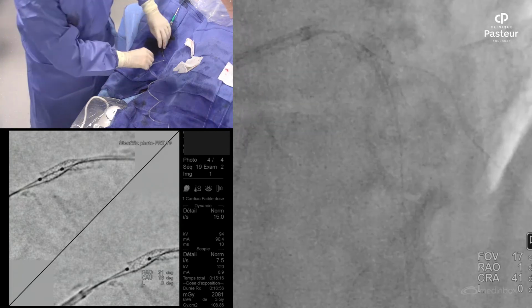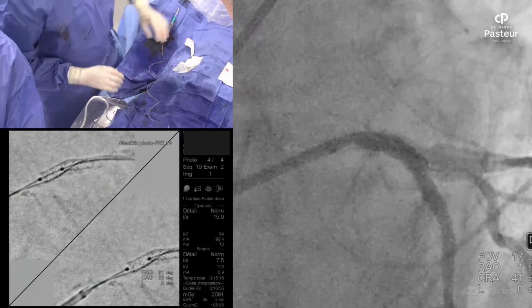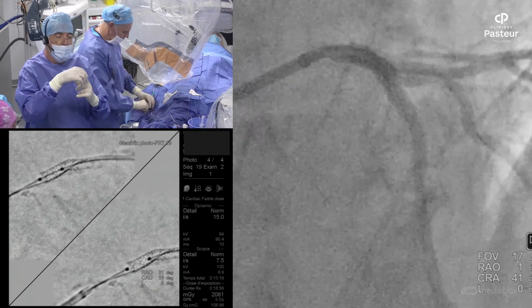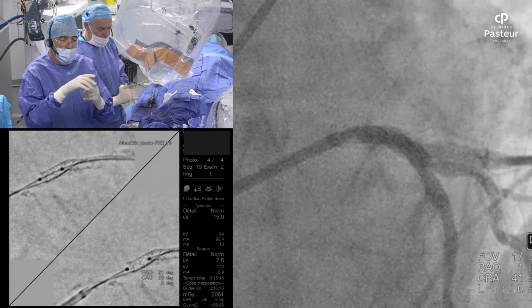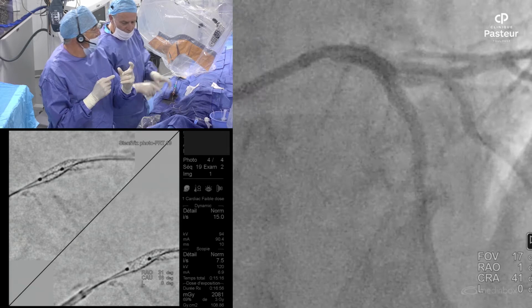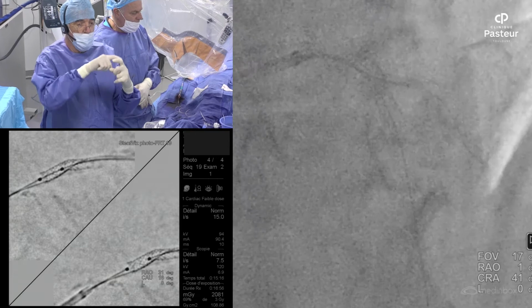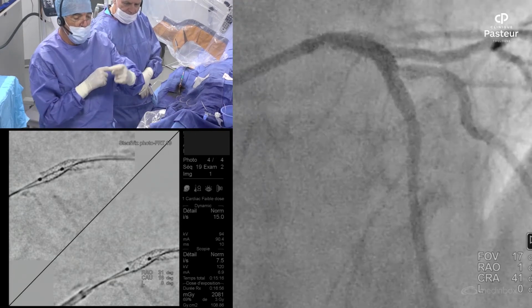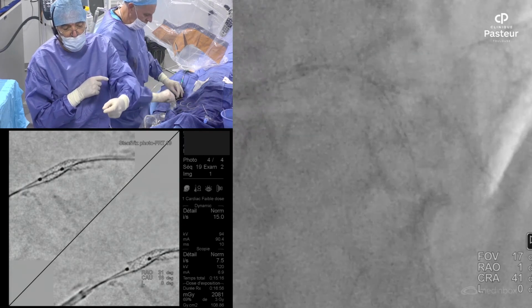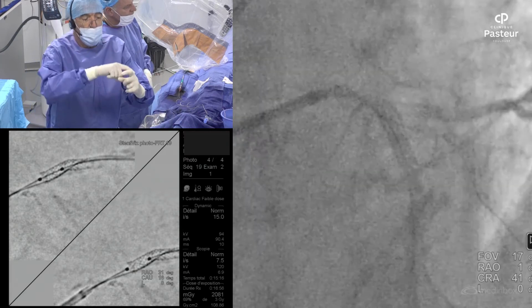That's very important. We cannot say that we use the same bend for all bifurcations. If you have a large proximal main vessel and a small side branch, we will have quite a large bend, cross the bifurcation within the struts, and distal to the stent turn clockwise and take the diagonal, but with a large bend.